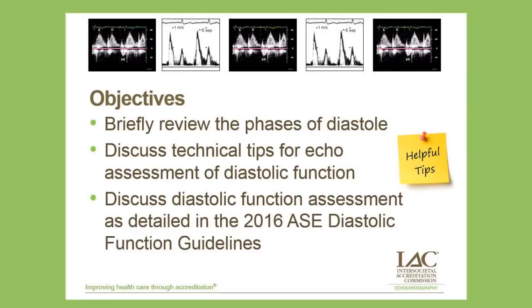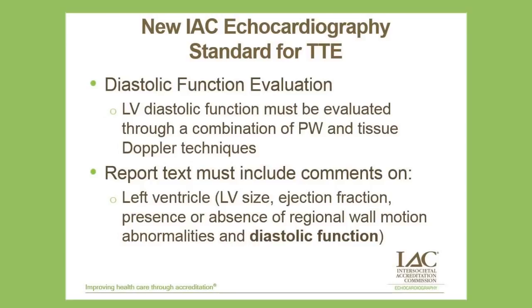The bulk of the discussion will be talking about technical tips for echo assessment of diastolic function, and then also we will discuss diastolic function assessment as detailed in the 2016 ASE Diastolic Function Guidelines. So the new IAC Echo standard for transthoracic that many of you should have seen already is that diastolic function evaluation is now a required part of a transthoracic echocardiogram.